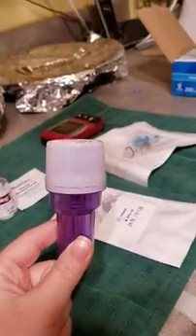And then I need new tubing, and we use the Clio site. Like we showed you. It's not one that you usually use with Animas, but yep, here's a Clio. We have a lot of trouble with sites, and so we're trying the Clios. So anyway, this is all that we need, and I like to get everything out of the package. So we'll be back when we have everything out of the package.